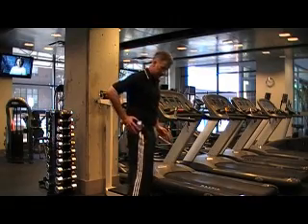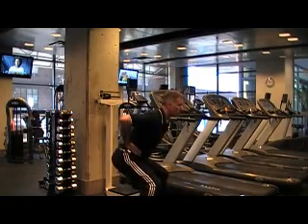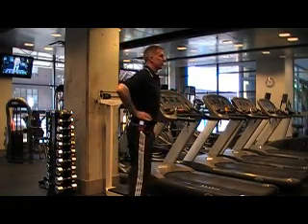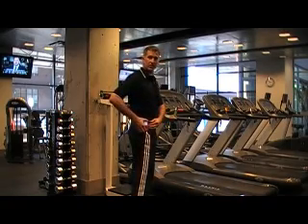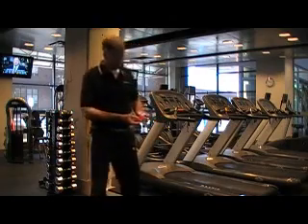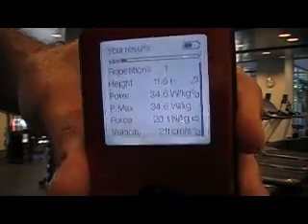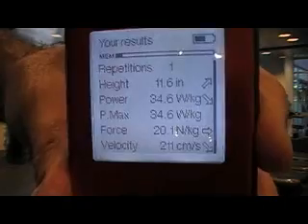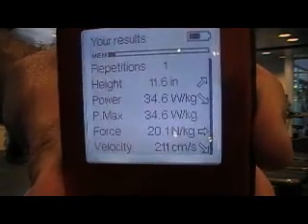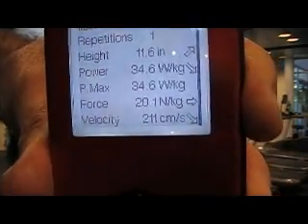I'll wait for the beat, drop down, hold, jump out, and come back to resting position. The double beep means the protocol was finished successfully. Once again, I have some instant results. Starting from a static position, my jump height is 11.6 inches, power 34.6 watts per kilo, force 20.1 newtons per kilo, and velocity 211 centimeters per second. I'm going to go ahead and save that information.